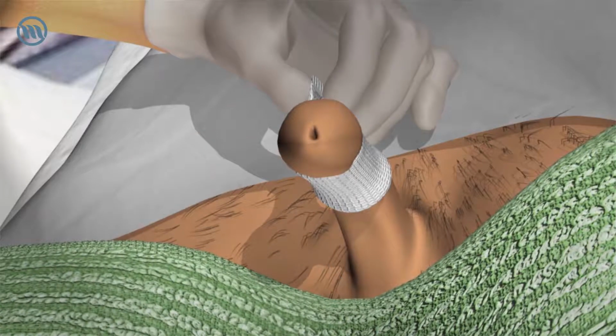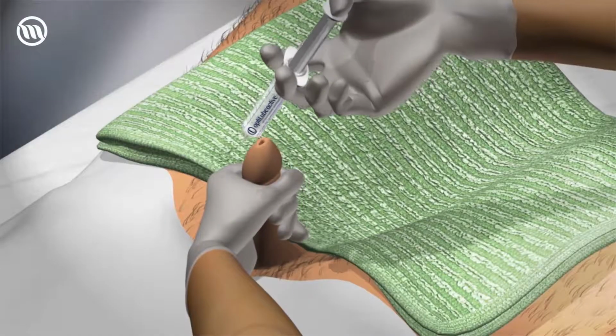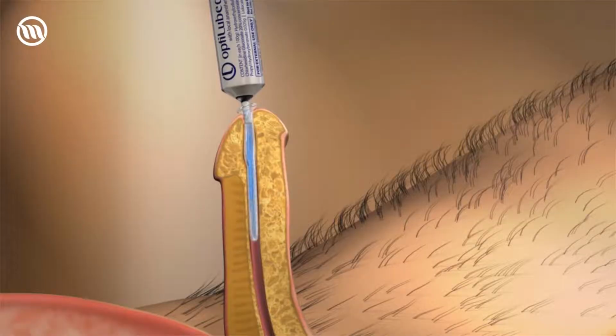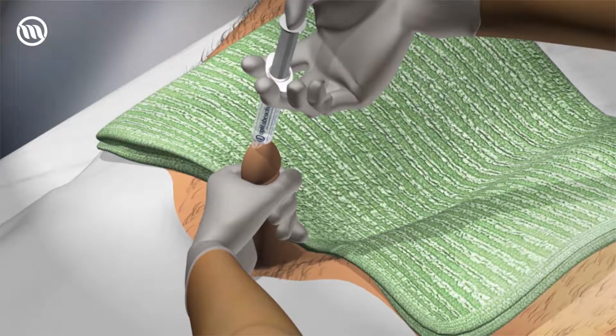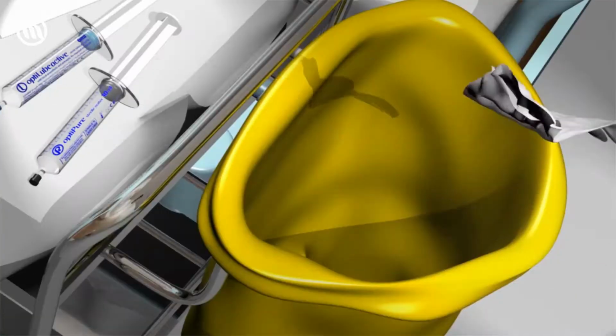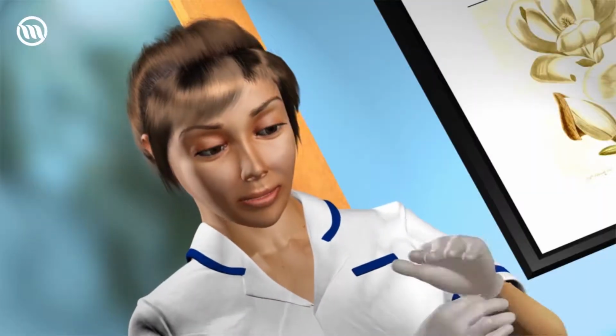Grasp the penis firmly below the glands. Take hold of the syringe of lubricating gel and apply a little to the meatal opening. Then gently insert the nozzle of the syringe into the urethra and slowly instill the 11 mL of gel. Apply gentle pressure to the penis with the swab in your non-dominant hand to prevent the gel from running out. If using a gel with a local anesthetic, wait for 3 to 5 minutes before inserting the catheter. Remove the gloves. Wash your hands or use a suitable cleansing gel and put on another pair of sterile gloves.